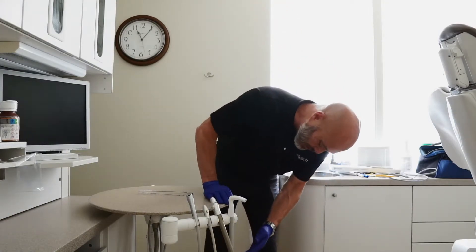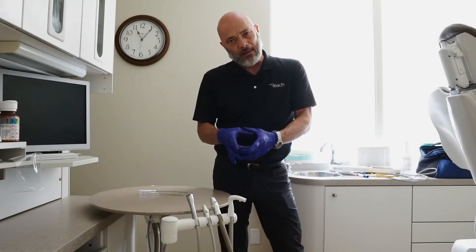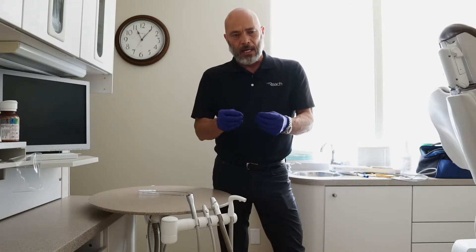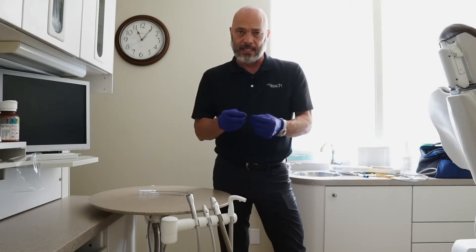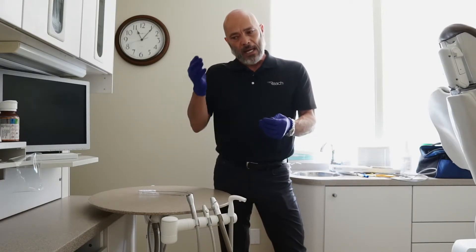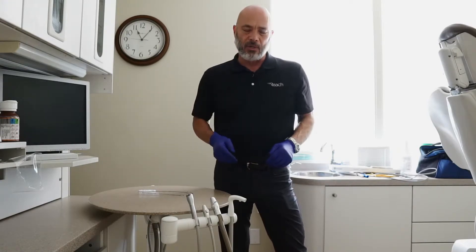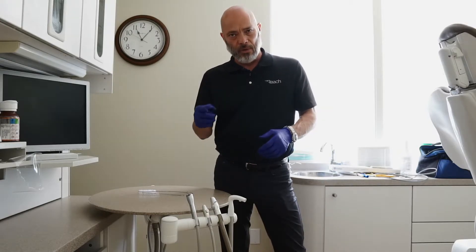Back to the delivery room traps — there's a solid trap in every room that collects any large debris. That should be checked on a regular basis to make sure it's cleaned out or replaced. Then you go through your building plumbing and back to your vacuum pump that provides vacuum. We'll go there next.